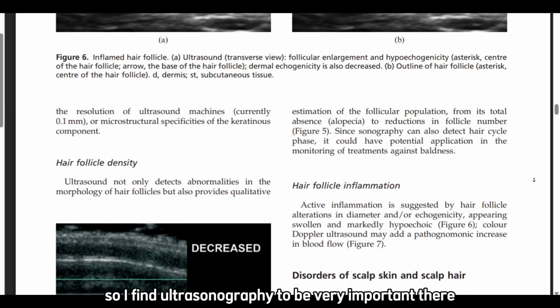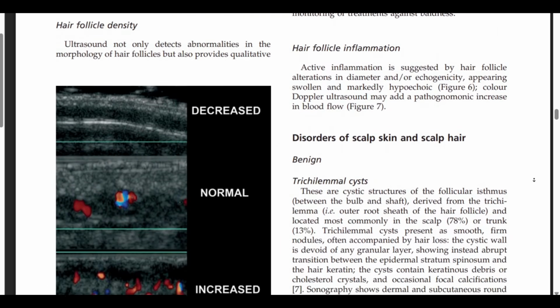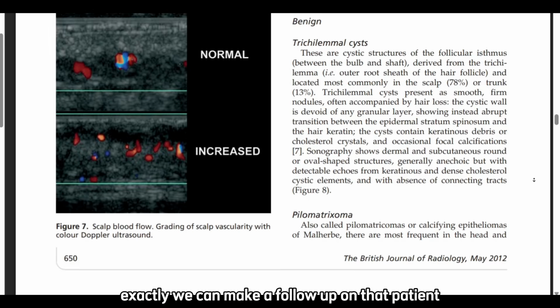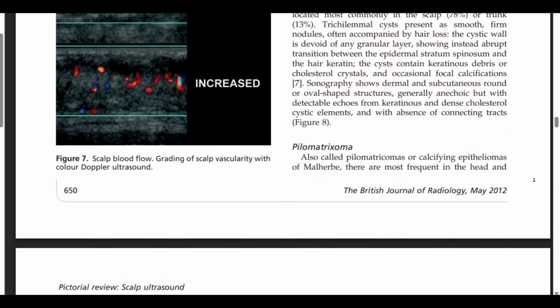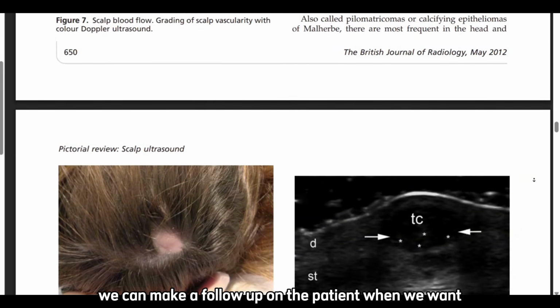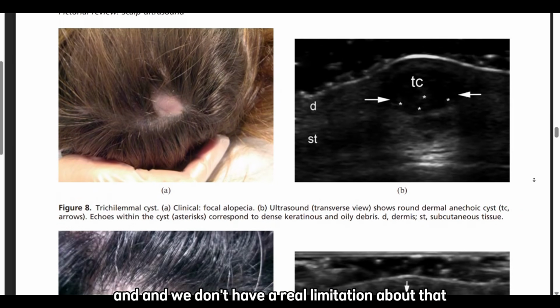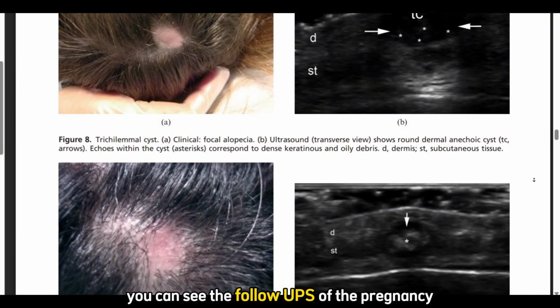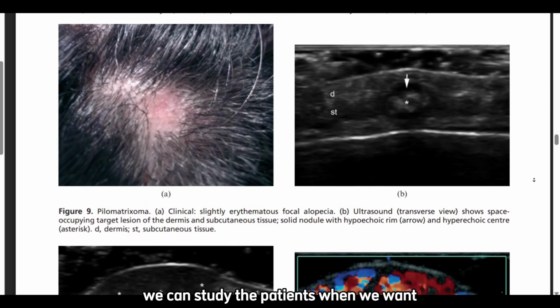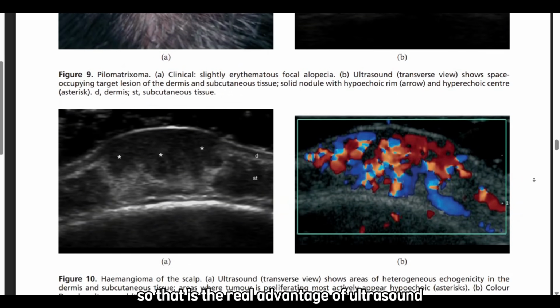So I find ultrasonography to be very important there, where you're giving an answer, sometimes within the same day. Exactly. We can make a follow-up on that patient. And since it's a safe imaging technique, because it is not a radiating technique, we can make a follow-up on the patient when we want. And we don't have a real limitation about that. You can see the follow-ups of the pregnancy, it is well known. We can study the patients when we want. So that is the real advantage of ultrasound.